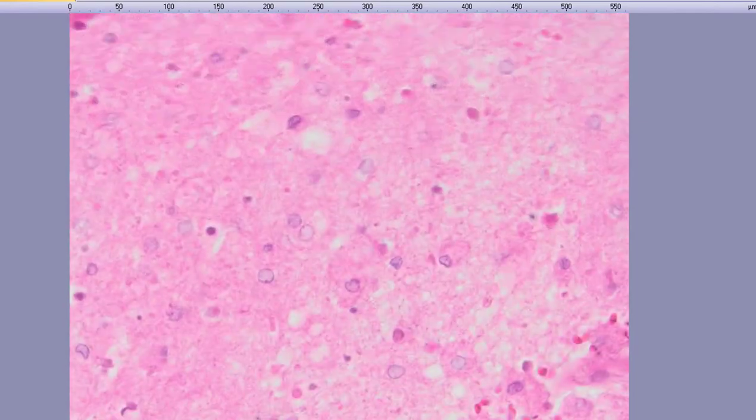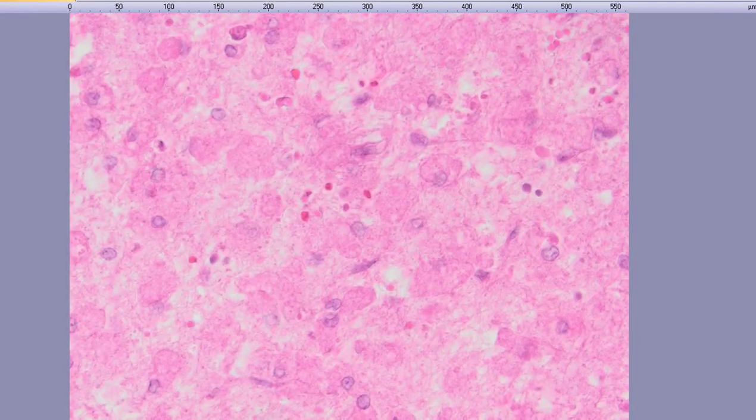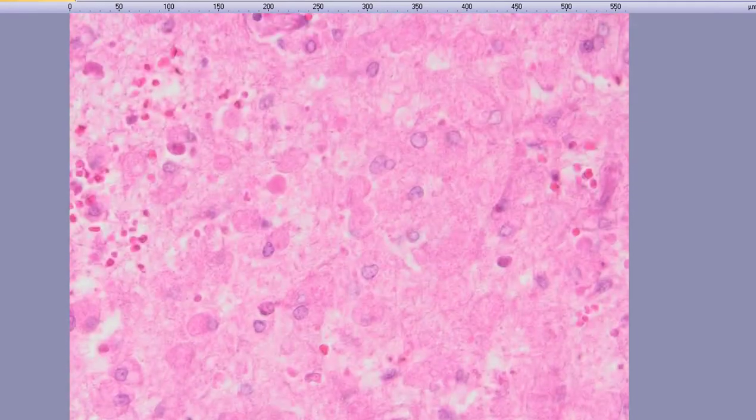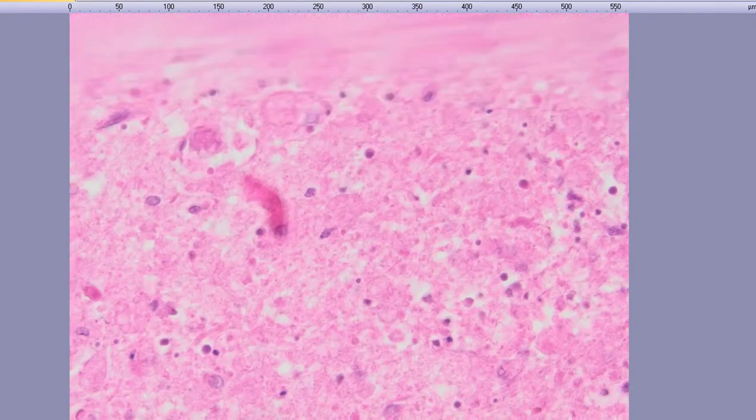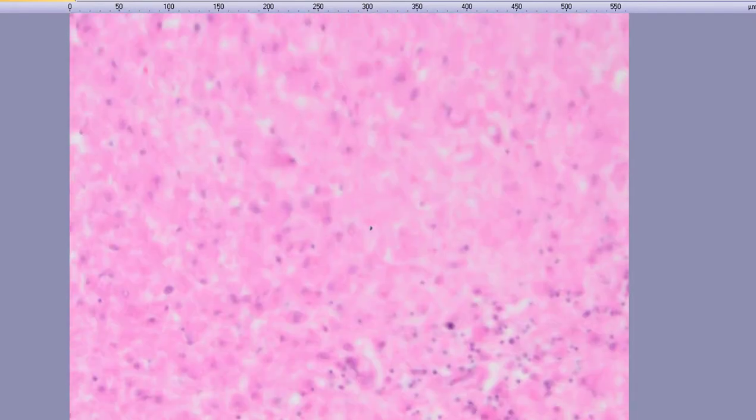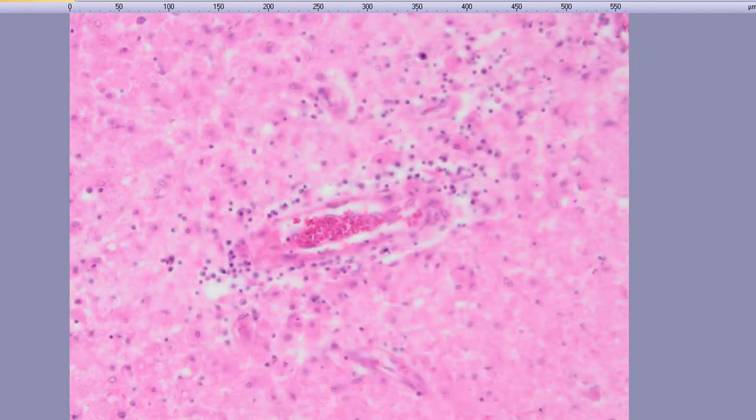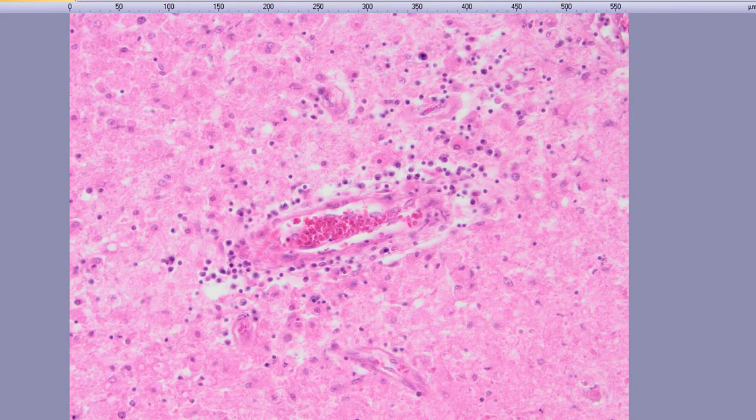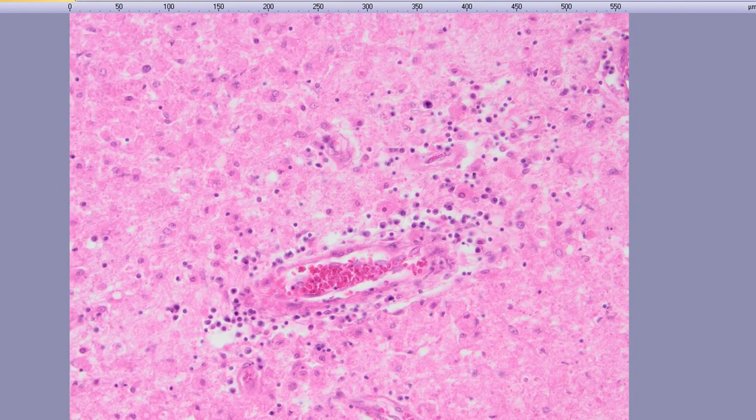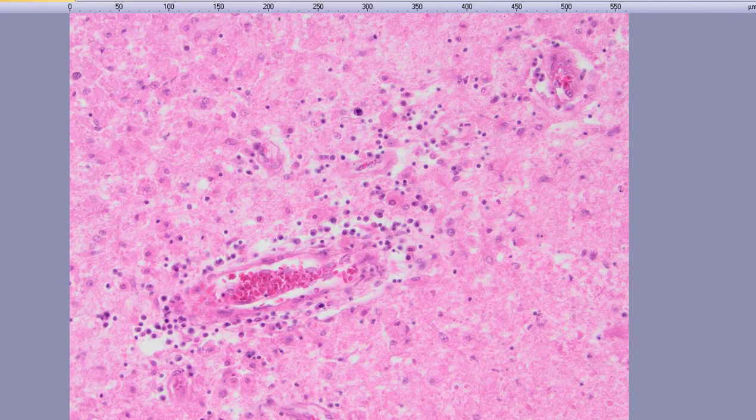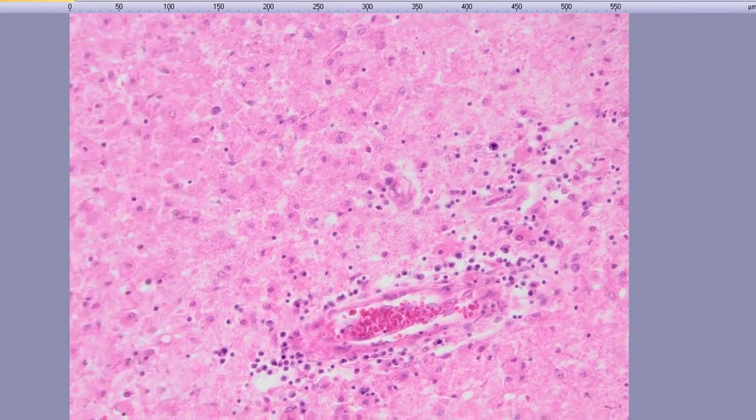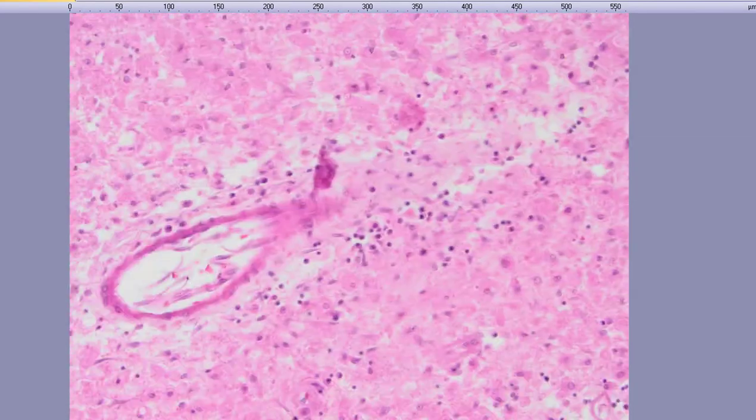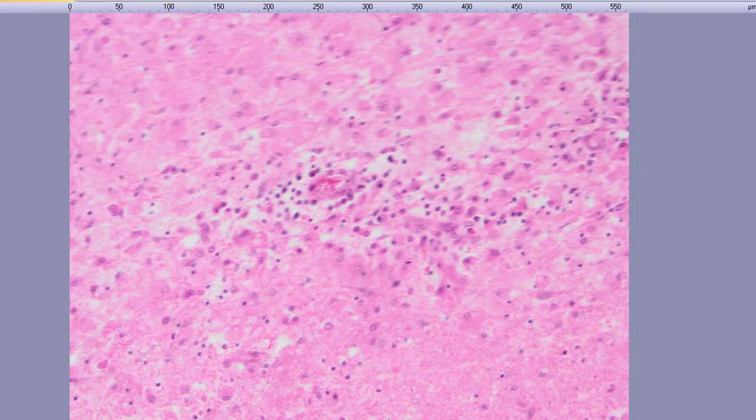You can also see necrotic debris in between, and then you've got a lot of macrophages. You've got these perivascular microglial nodules composed of monocytes mostly and probably microglia.